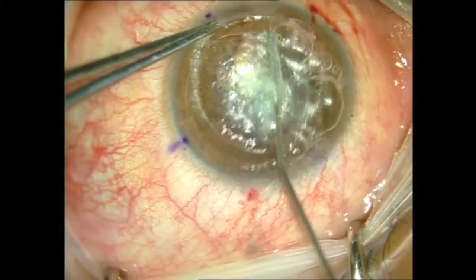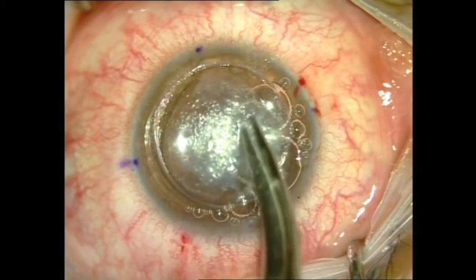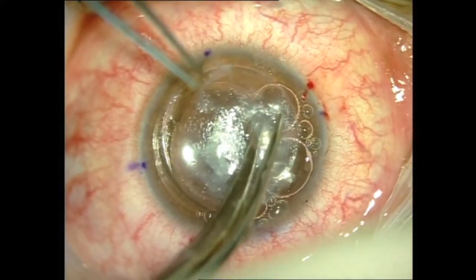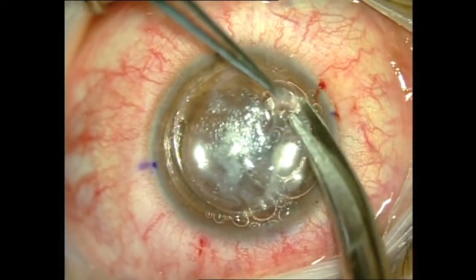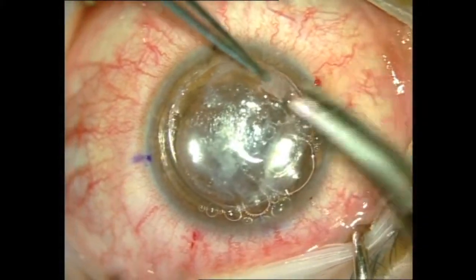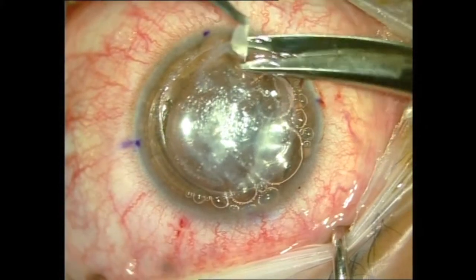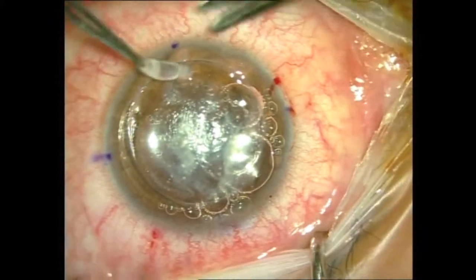After completing dissection, the separated part of the stroma is divided and each part is cut till the trephination groove, exposing the underlying bed. The underlying bed is then inspected, and in this case we find that there are still some microbubbles, indicating that we need to remove more layers of the stroma.